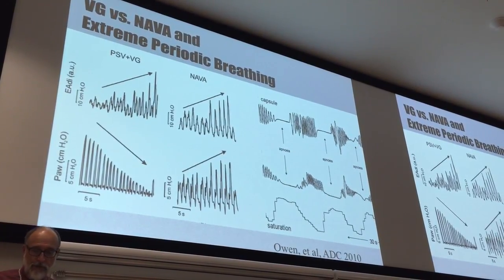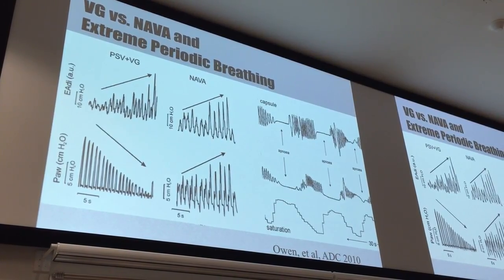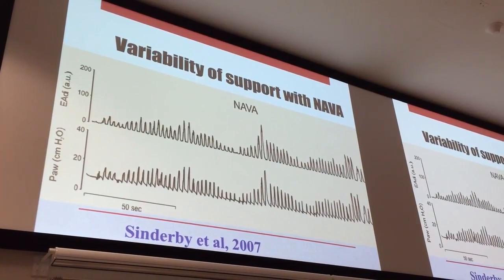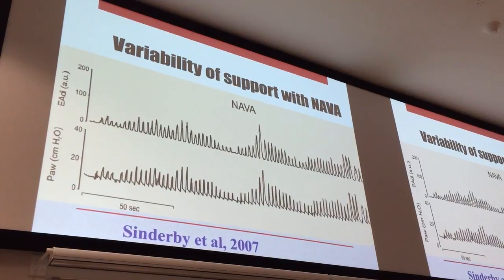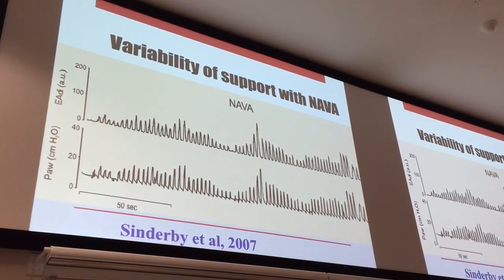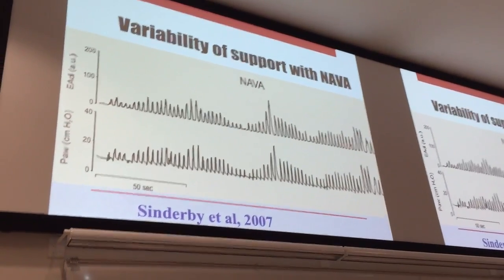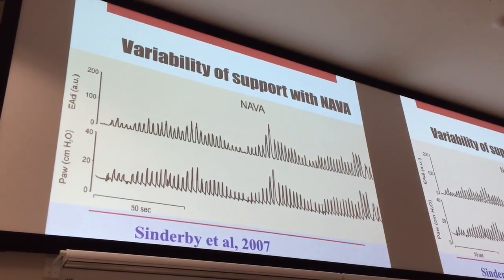NAVA was not initially developed for preemies. It has been applied to preemies, and I'm still a little bit of a skeptic. Non-invasive, not a lot, and we're working together on that protocol because I think non-invasive is the way to go. It makes me less worried about overshooting. I know you can put limits on the peak pressure, and with an open system, non-invasive doesn't worry me so much.